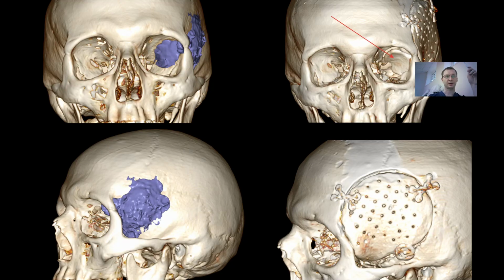I already mentioned guided resection and simultaneous reconstruction with prefabricated implants. Here you can see such a case with one-stage resection and closing. You can see that the roof was reconstructed in the most anatomically correct way. Here silicone molds allow us to create even such complex implants as this one with the roof of the orbit.